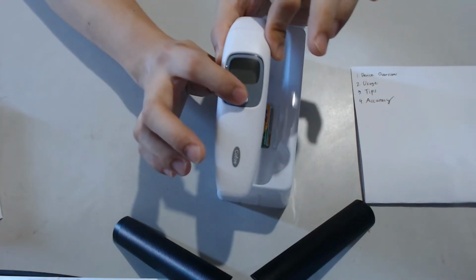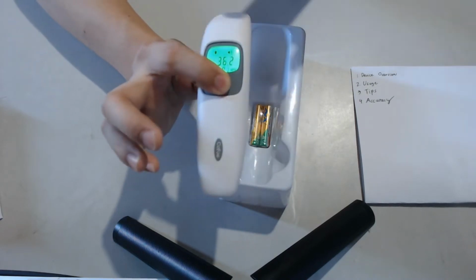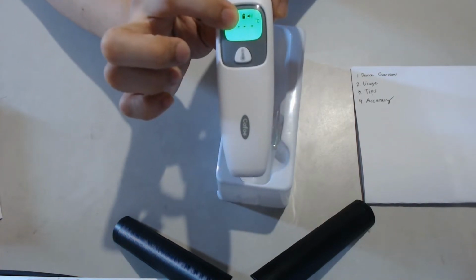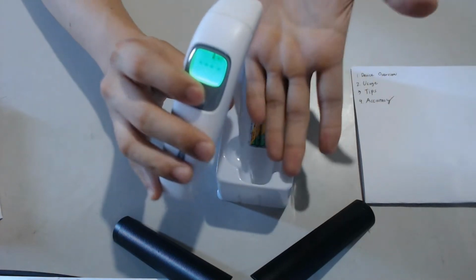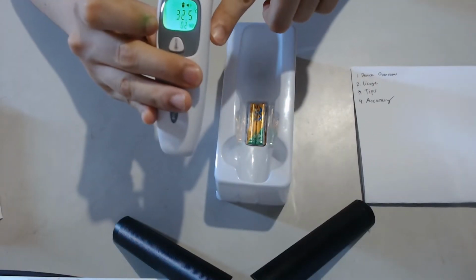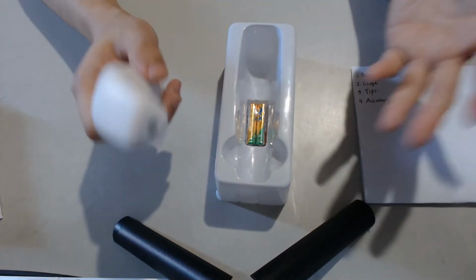To do that, turn it on, then hold it for 3 seconds. 1, 2, 3. Now you see the picture is replaced with a house. So it's not a picture of a forehead or an ear, but a house. This is an object measurement mode. It will measure the thing as it registers in the sensor. This has its uses when you want to measure things like boiling water, etc.